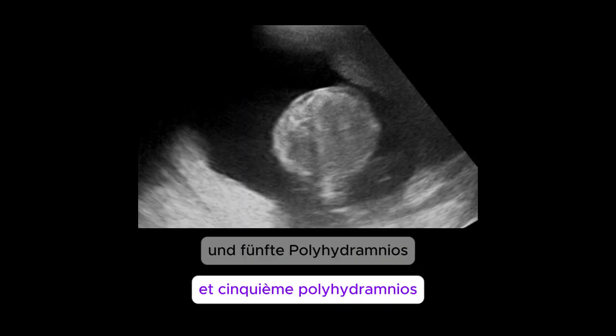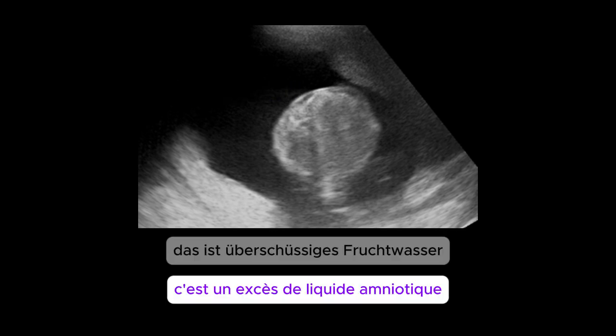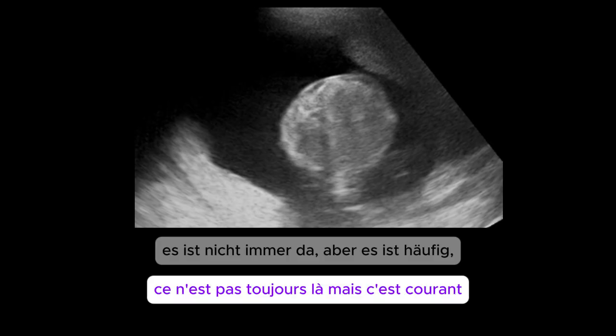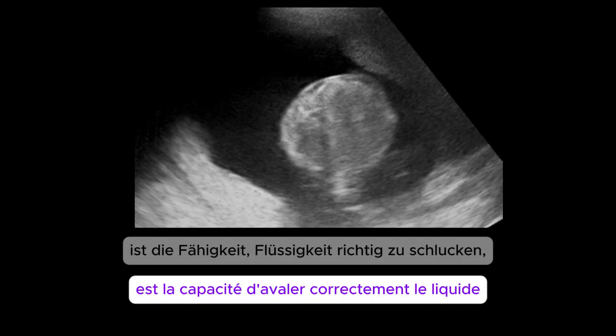And fifth, polyhydramnios. That's excess amniotic fluid. It's not always there, but it's common because the bowel issues can impair the fetus's ability to swallow fluid properly.